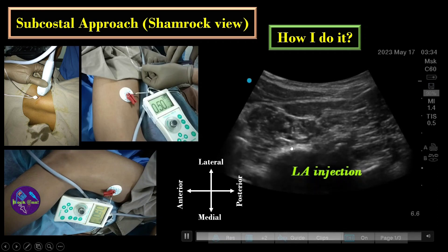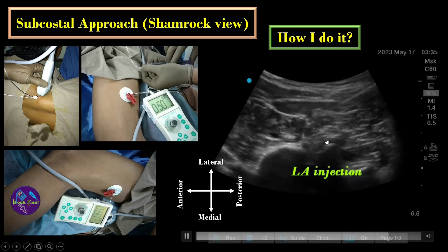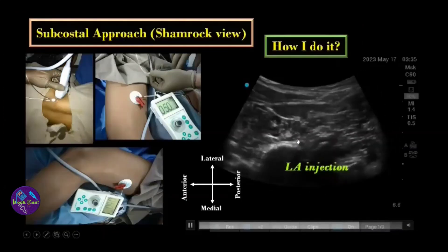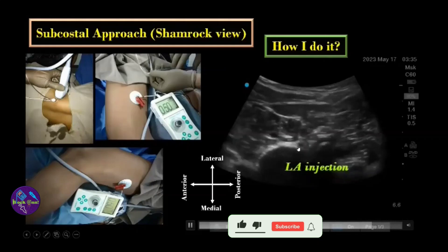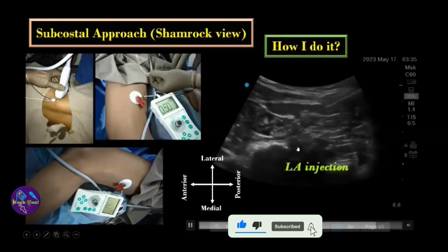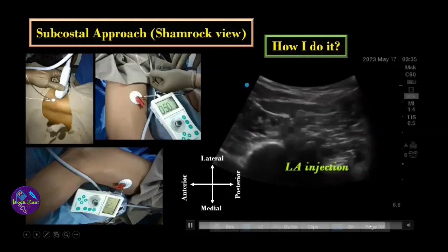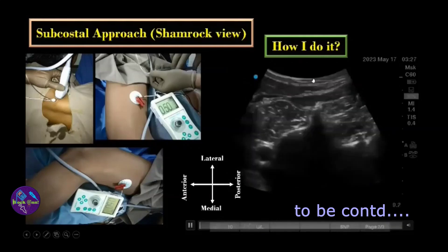Look for the antegrade spread of local anesthetic while injecting the drug. It should create an oval-shaped layer around the neural element of the lumbar plexus and should not spread towards the intervertebral foramina, as spread in that direction is a positive factor for epidural spread and bilateral block. If the drug goes in the antegrade direction and post-block scanning shows an oval-shaped drug spread around the lumbar plexus element, that is your perfect lumbar plexus block with no expected complications.